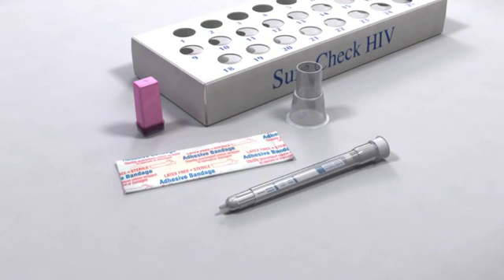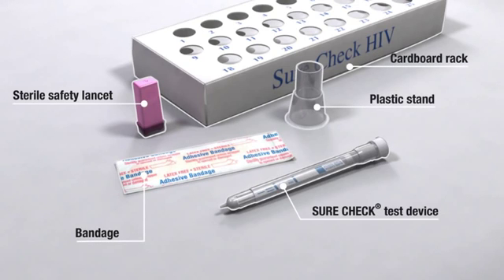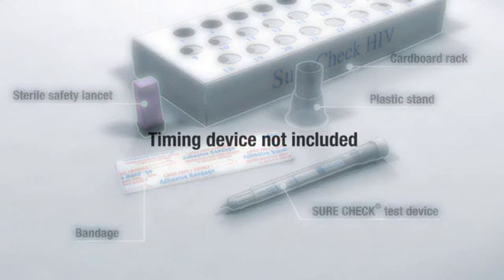The SureCheck HIV-1 and 2 test contains the following components: the SureCheck test device, a sterile safety lancet, a bandage, and either a disposable plastic stand or a disposable cardboard rack. Materials required but not included: a clock, a watch, or other timing device.